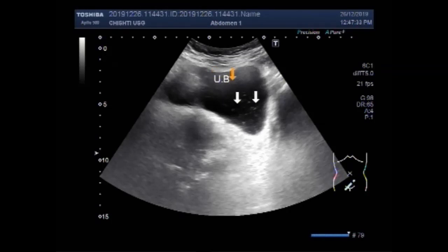This is the urinary bladder, and this is the sludge seen in the urine present in the urinary bladder.